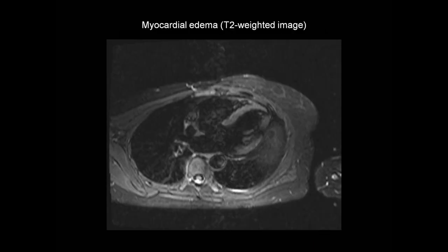This is a T2-weighted image. In this image, we look for evidence of either regional or global increase in myocardial signal intensity — one of the Lake Louise criteria. This is the left ventricle, the right ventricle is just here, and the two atria are here. The left ventricular myocardium appears quite bright, so we have an increase in myocardial signal intensity in this T2-weighted image, meeting one of the Lake Louise criteria.